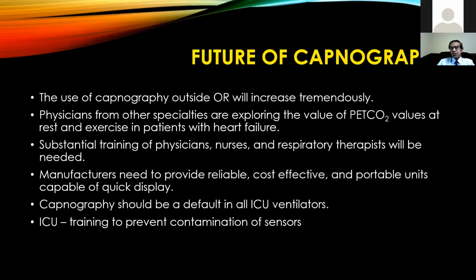And what is the future of capnography? The use of capnography outside the operating room will increase tremendously. Physicians from other specialties are exploring the value of capnography at rest and exercise in patients with heart failure, whether it is a sensitive device to determine if the patient has heart failure. Substantial training of physicians, nurses, and respiratory therapists will be needed if we are going to implement capnography across. Manufacturers need to provide reliable, cost-effective, and portable units capable of quick display.